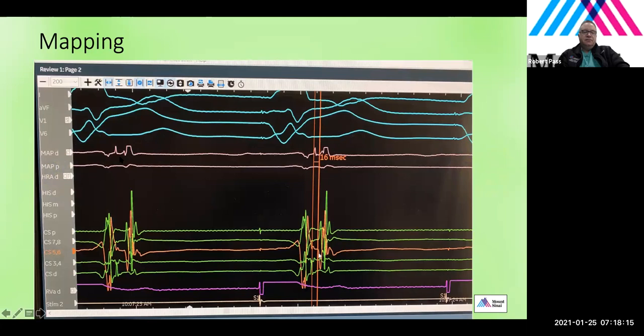Anyway, now we're in the left atrium, and we decided that we were going to do this in ventricular paced rhythm. We could map this in multiple ways. We could map in sinus rhythm, mapping for the earliest ventricular electrogram. We could map in tachycardia, looking for the earliest retrograde atrial electrogram. Why don't I ask Neha, what would be the disadvantage of mapping and ablating in tachycardia, do you think? What would be the benefits and what would be the downside?